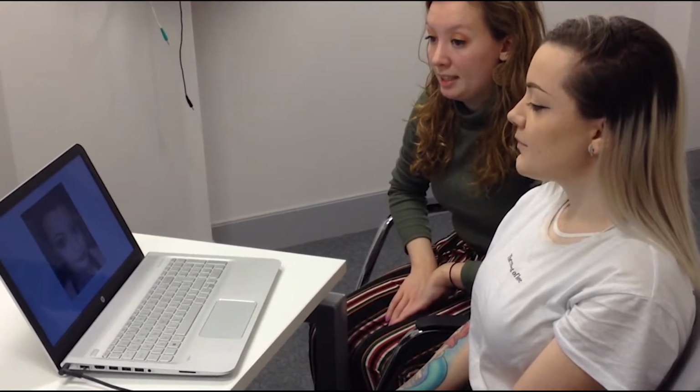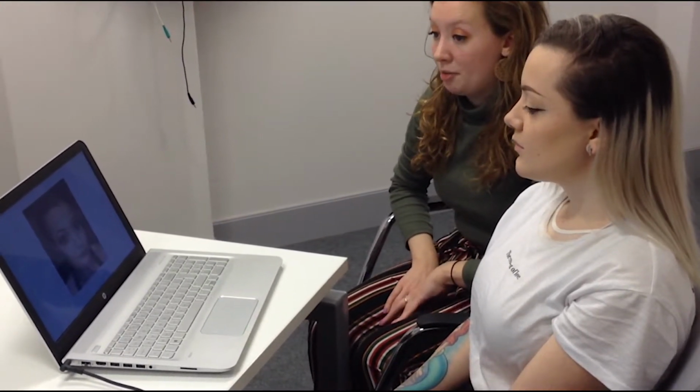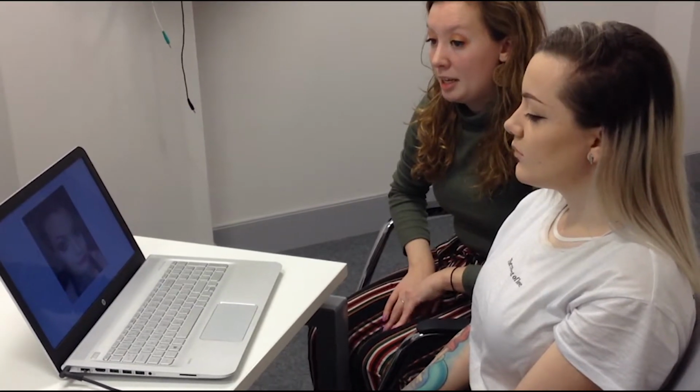So, this image begins the irrelevant relevant odd series of the experiment where all irrelevant images are presented, along with the relevant image the participant has been asked to keep in mind and the odd image of a pet.